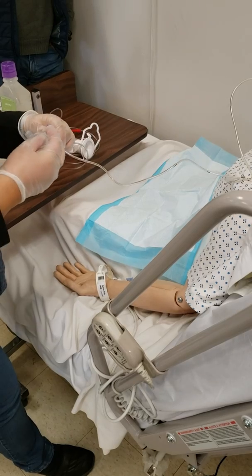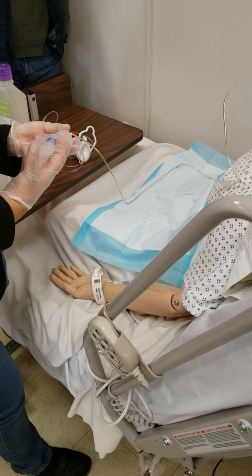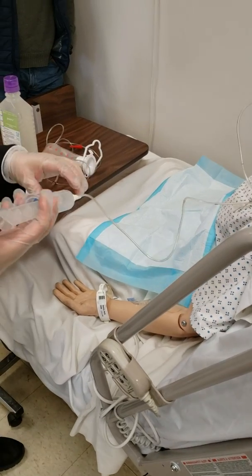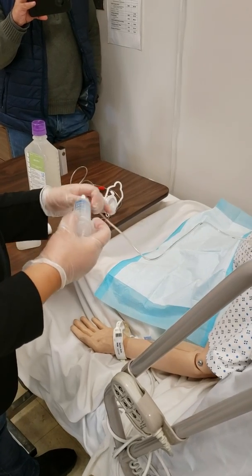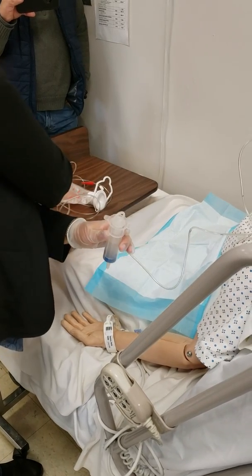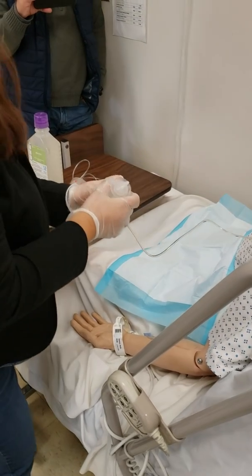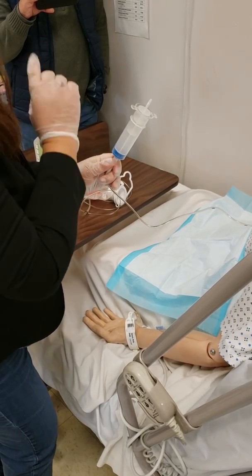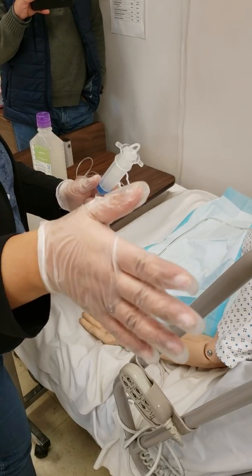The other scenario is you aspirated like 60, and there's a resistance. That means it's empty. You just push it back, or leave a little bit. Yes, you have to leave a little bit, and you put it over here and grab your pH paper and check if it's acidic. It has to be acidic. The other scenario, so that's 100 or less is normal. It's good. You have to push it back and continue with the feeding.